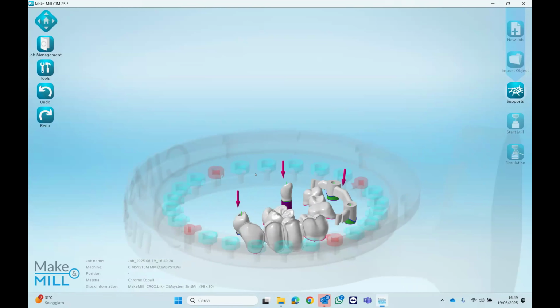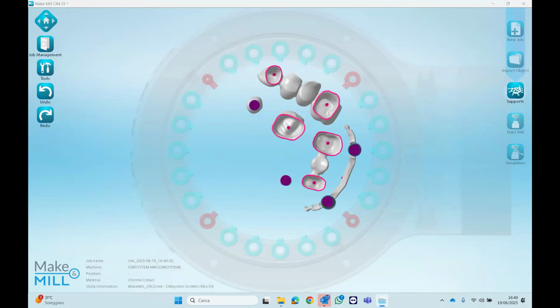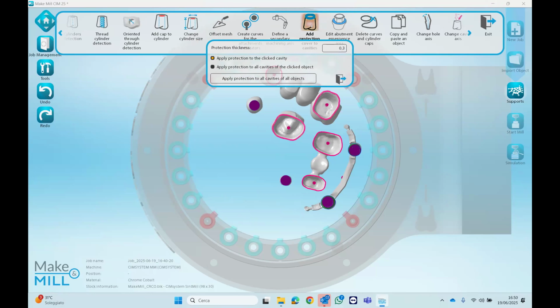We will apply the protection layers of all the materials that will later be cleaned during the machining, okay? So I will spin this around like this. Okay, so to add material to the cavities is real easy. Always inside Tools, Curved Surfaces, you have a dedicated tab called Add Protection Cover to your cavities.